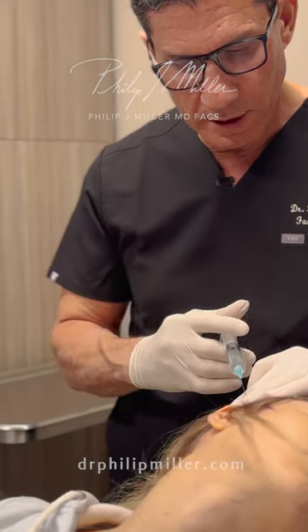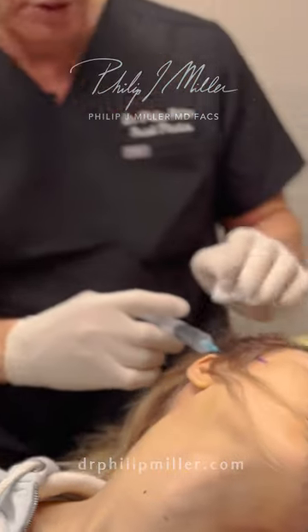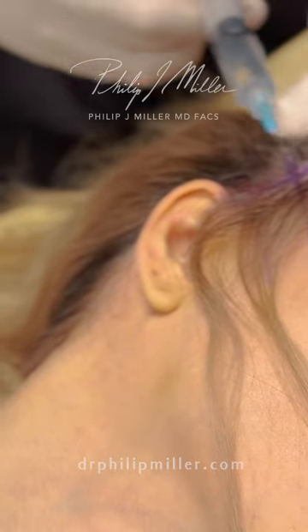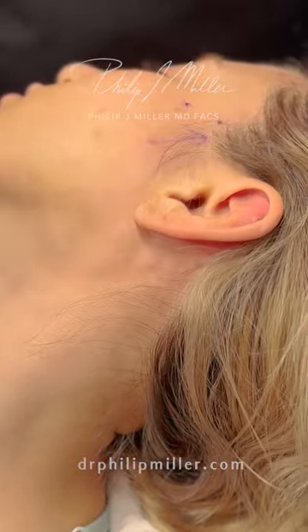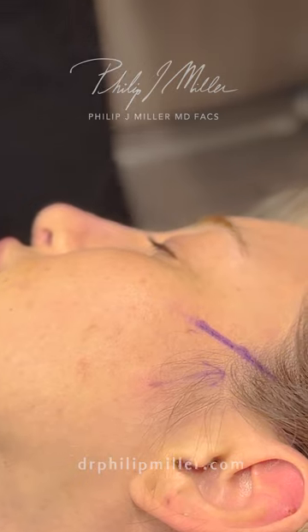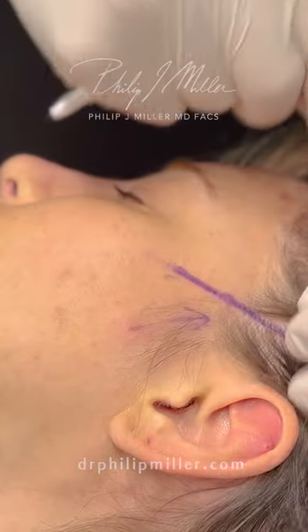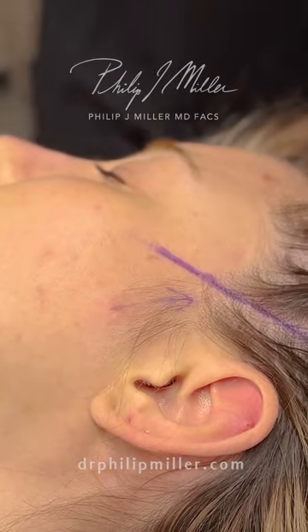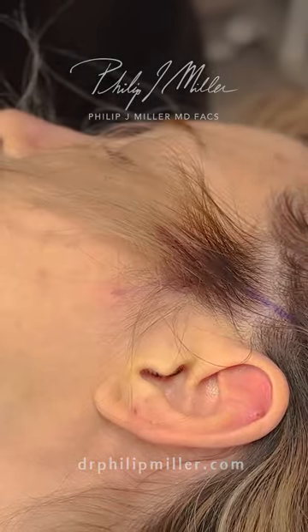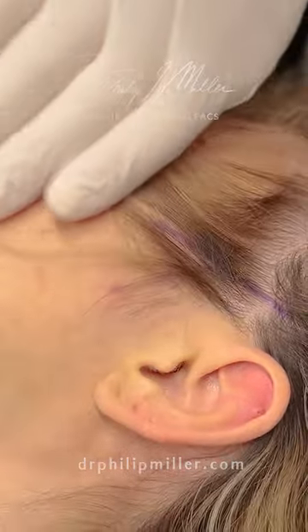I'm going to numb a little bit more inferiorly now — you're going to feel this a little bit as I come down here. I'm just injecting a little inferiorly here. We had drawn the two lines right here and here. We're going to follow that directly into the hairline, take the Q-tip to expose it as it goes in here. Then we're going to go perpendicular to that, roughly right around here, and create a nice line that is perpendicular but staying within the hair-bearing skin.